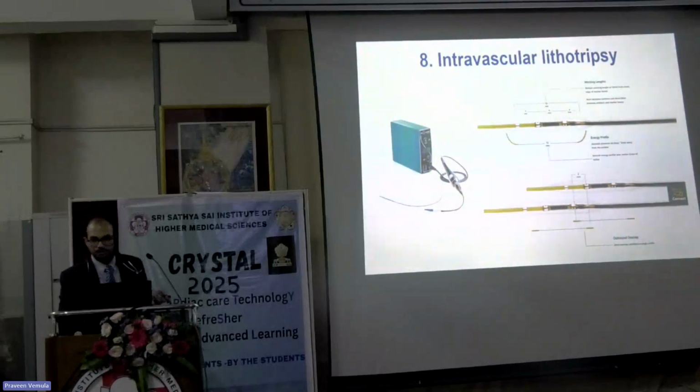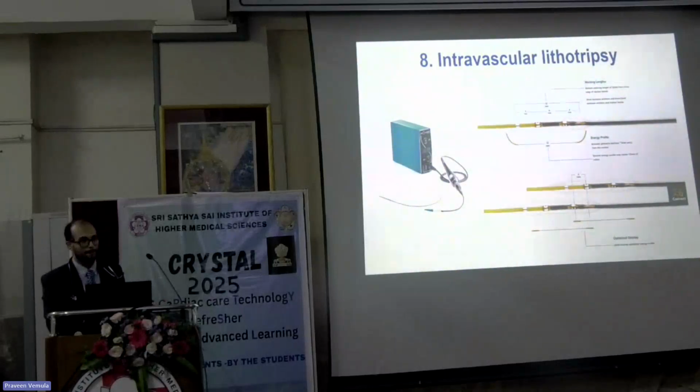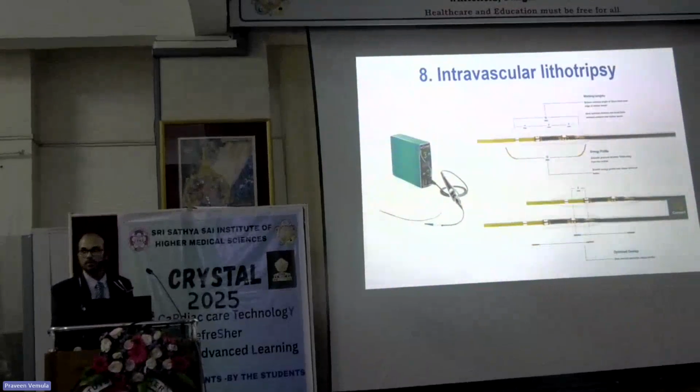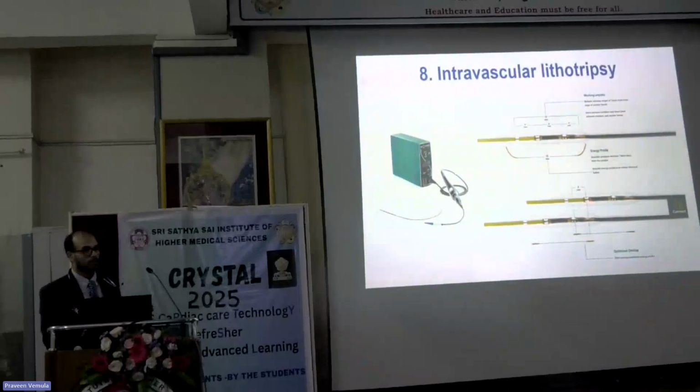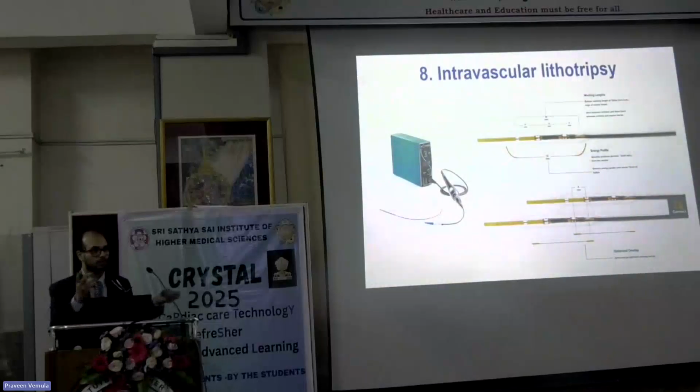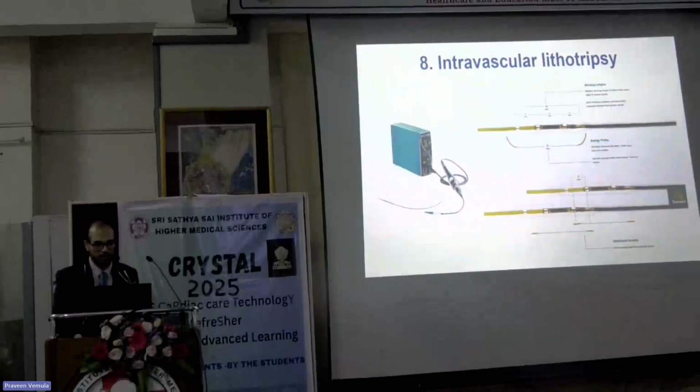This could be asked because again, this is used in current practice for calcific lesions. This is like giving an ultrasound into the heart. You just pulse the calcium by giving more pulses. It's called intravascular lithotripsy. I'm sure you've all seen it in your hospitals. Basically, it's what they used to use for kidney stones, to basically break the calcium, right?